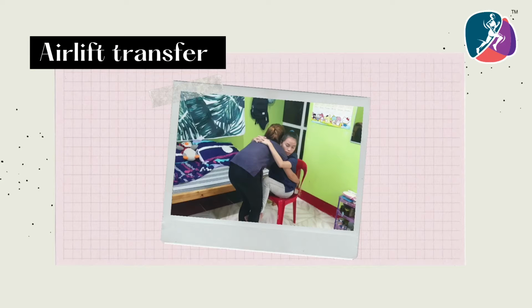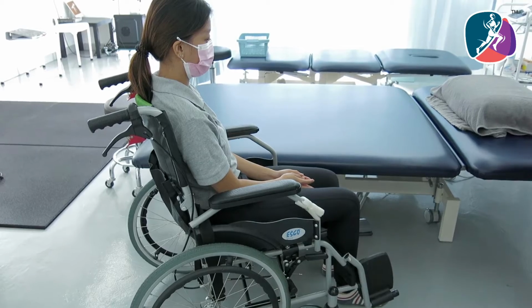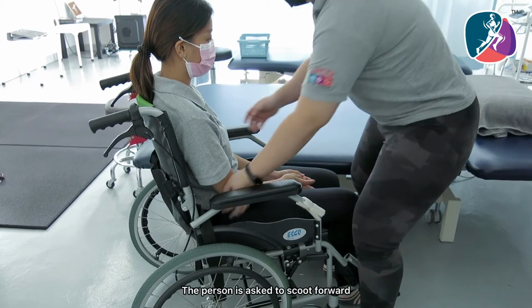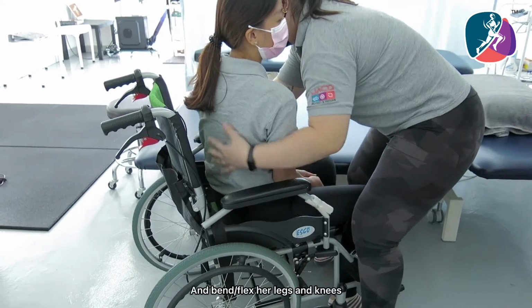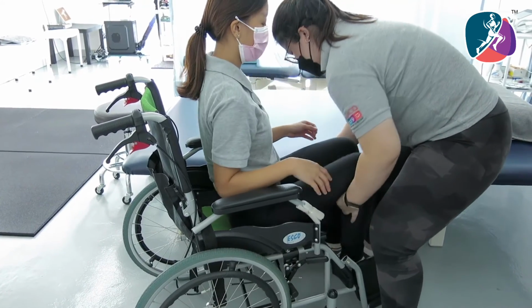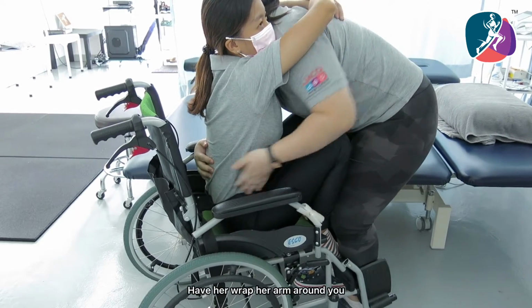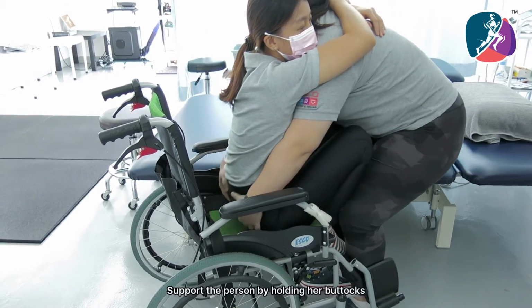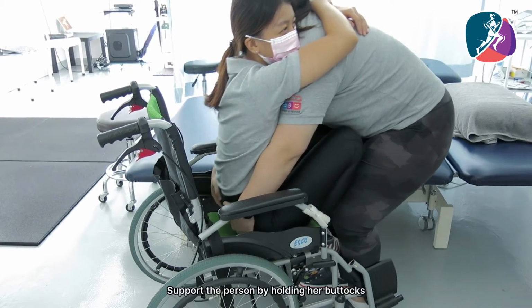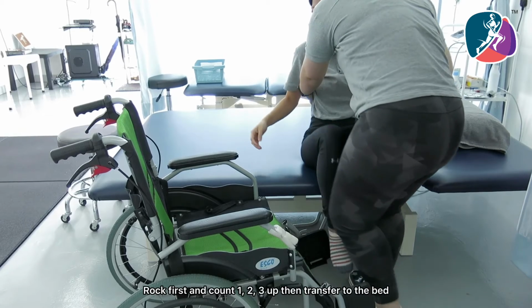Airlift transfer. The person is asked to scoot forward and bend or flex her legs and knees and place them on the caregiver's front thighs. Have her wrap her arm around you. Support the person by holding her buttock. Rock first and count 1, 2, 3 up, then transfer to the bed.